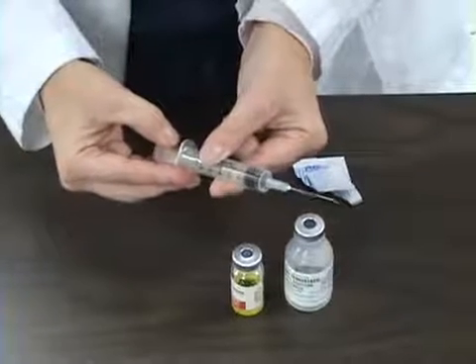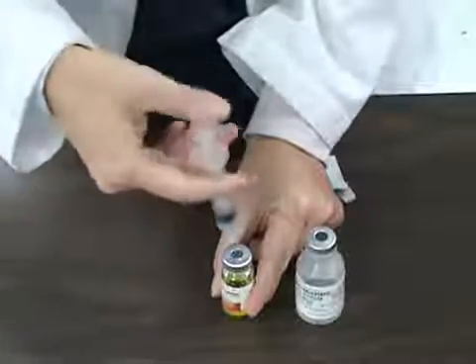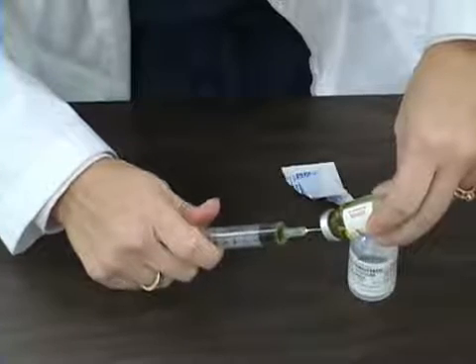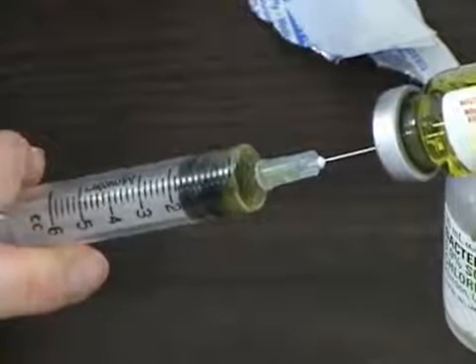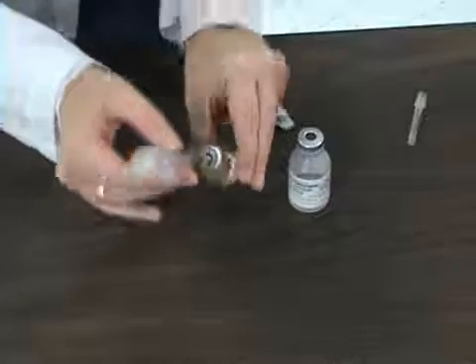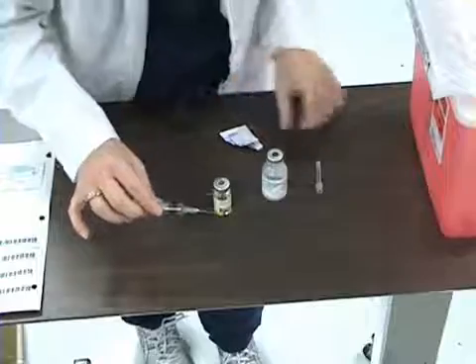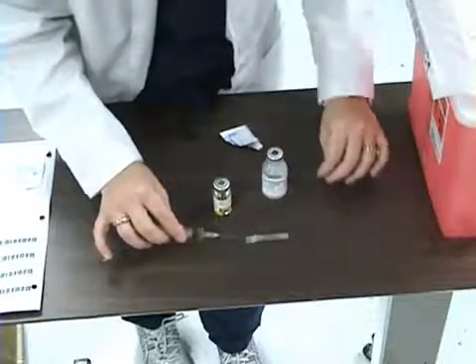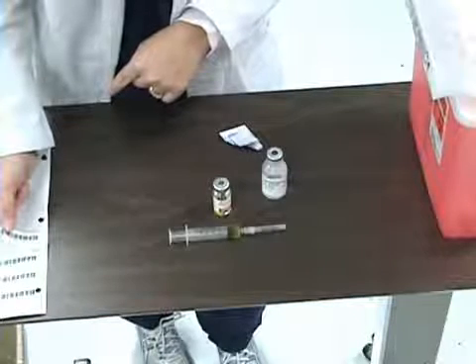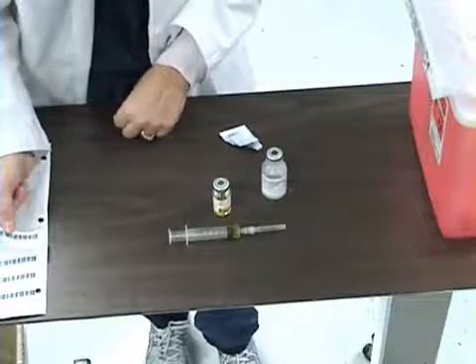I will pull the plunger back to the 1 ml marking on the syringe. I will inject the air. Now I will passively recap the needle. I will label my syringe using a patient label on which I have written the drug, the dose, and the route.